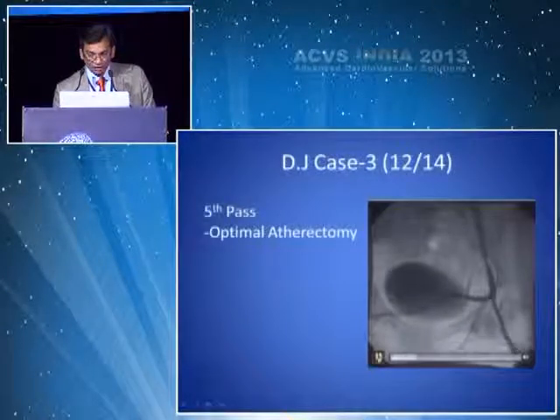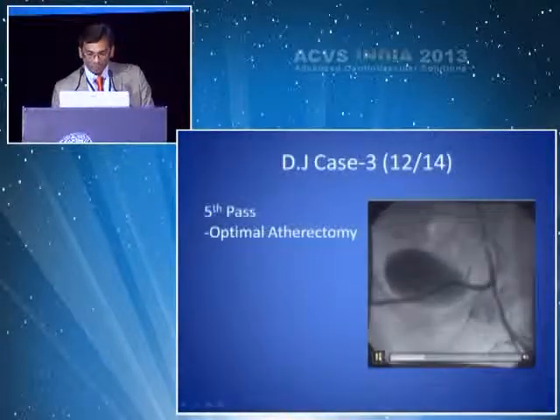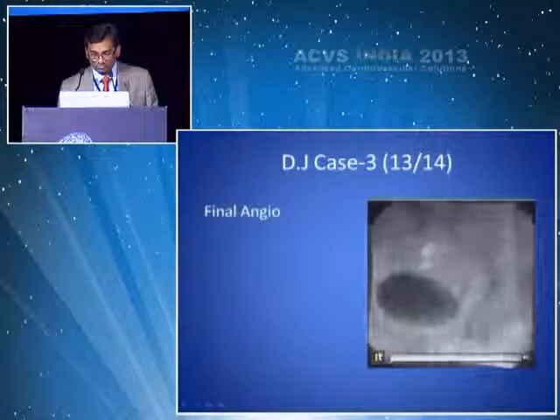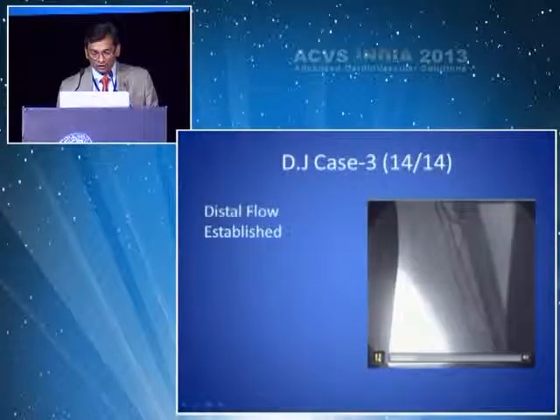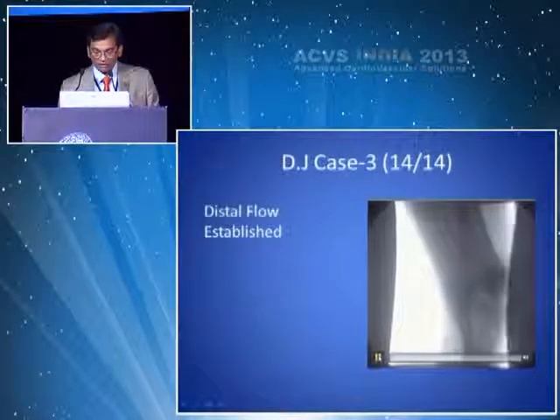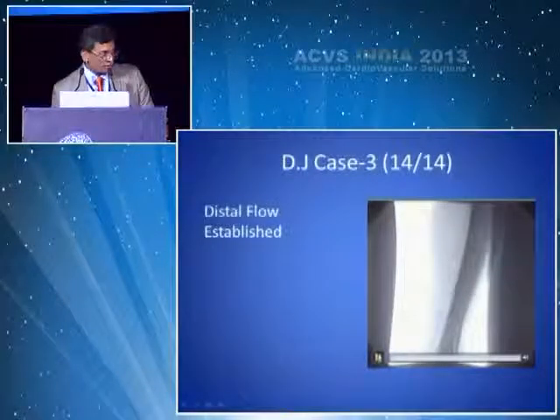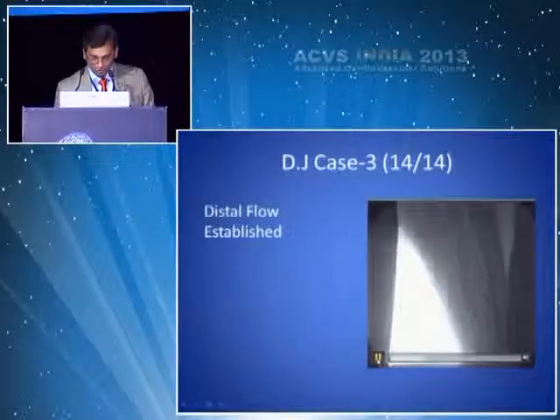There was still some disease, and that's the final result of the atherectomy. As you can see, the distal one is completely open. Now he's got flow on both sides through the fem-fem graft, and there is distal flow established, as you can see. Let it run through to the foot. And the heel gangrene actually healed naturally, scuffed off without any secondary infection, and the guy was discharged home.